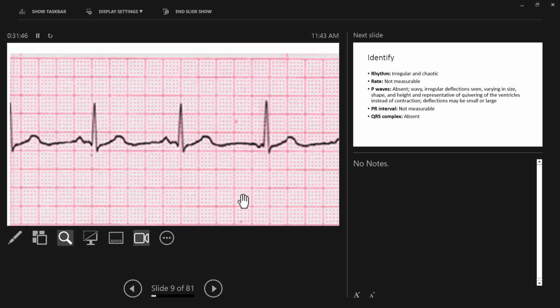Which tells us what is causing that? Where's that one actually coming from? Which is called the... starts with a J. Junction. Okay. So the AV junction is actually at the very bottom of the right atria. So you're exactly right. These are coming from the atria. This is coming from the junction. How do we know it's coming from the junction? Why is it inverted? What makes it inverted?